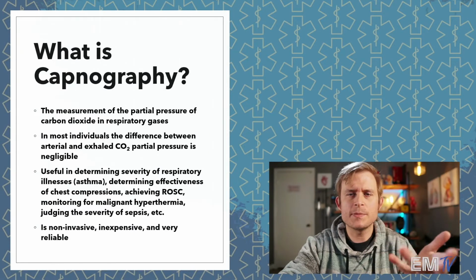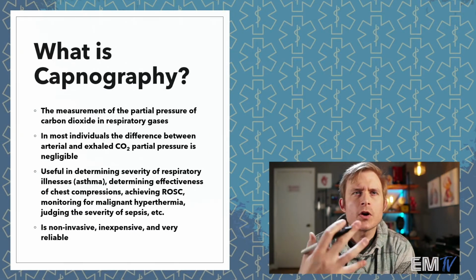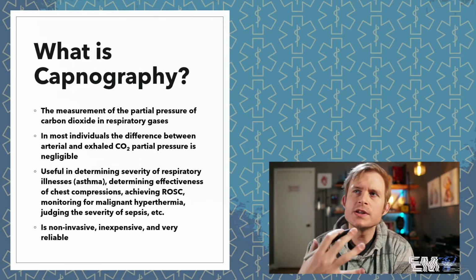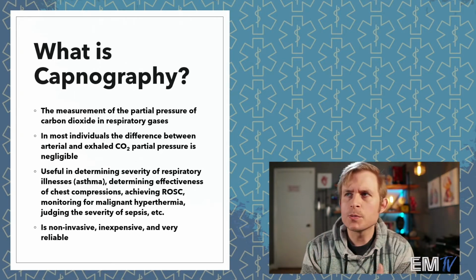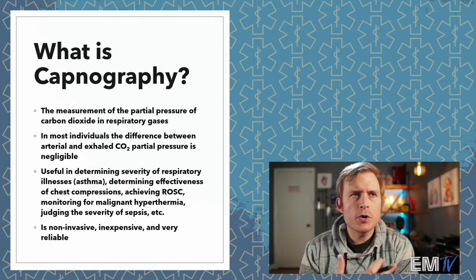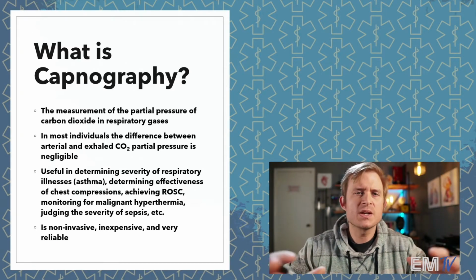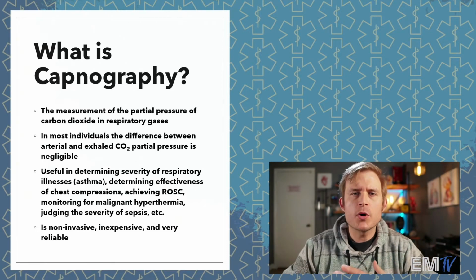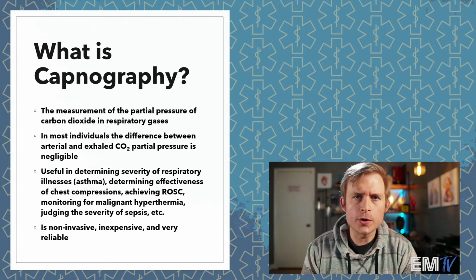So what is capnography? Well, capnography is a measurement of the partial pressure of carbon dioxide in your respiratory gases. Specifically, we're looking for carbon dioxide because it is a good indicator of overall metabolic process and state in your body. Now, a partial pressure means that within a complete quantity of room air, it is a small amount of gas that makes up that total volume.